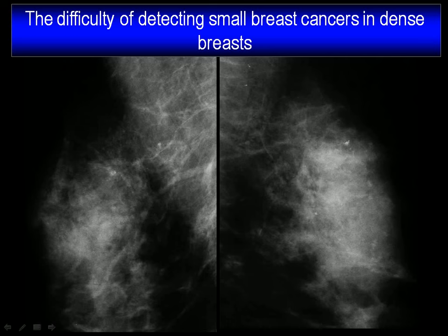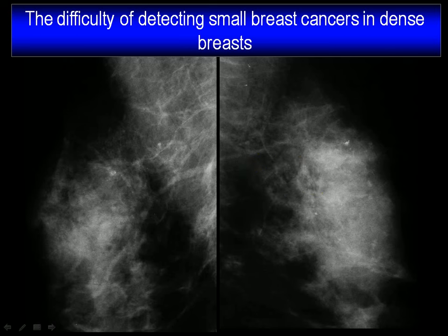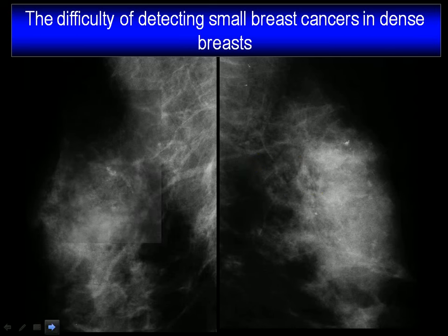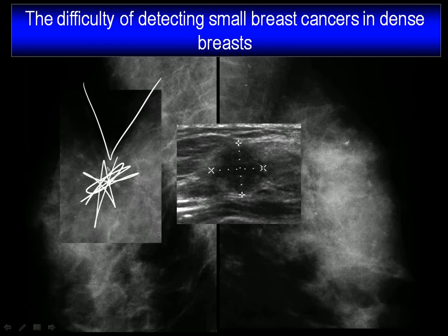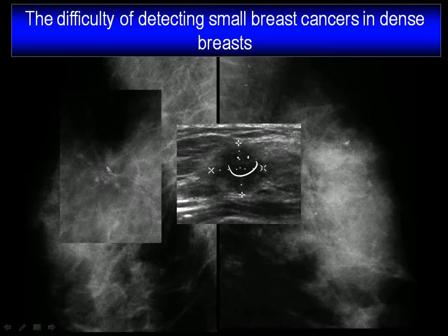Here is an example. This patient has a 25 mm node-positive breast cancer right in front of you. Could you find out whether it's the right or the left? It is in the right breast, as you see this acute angle pointing out where the stellate lesion is. However, the mammogram is negative. But ultrasound can easily find it.